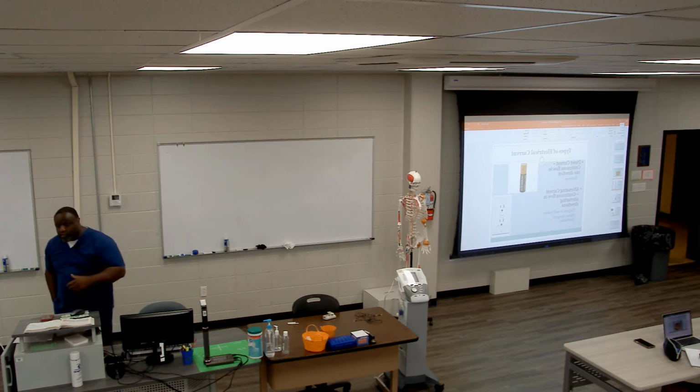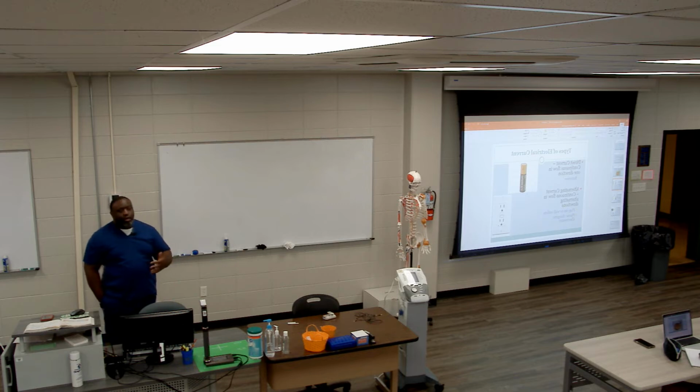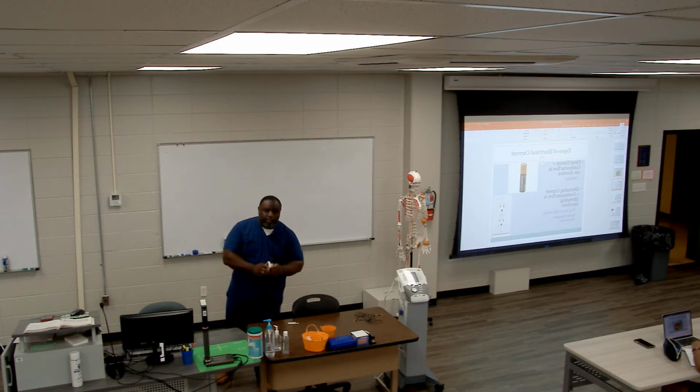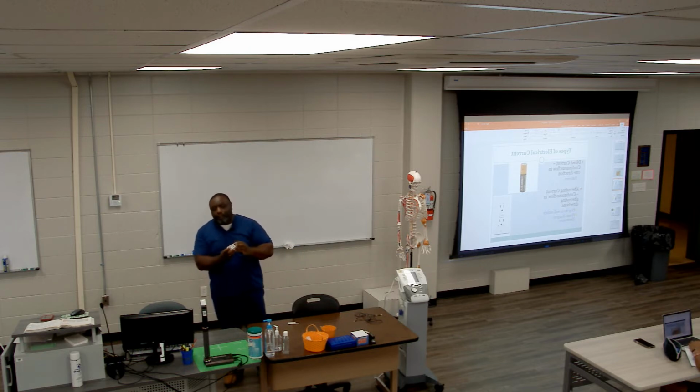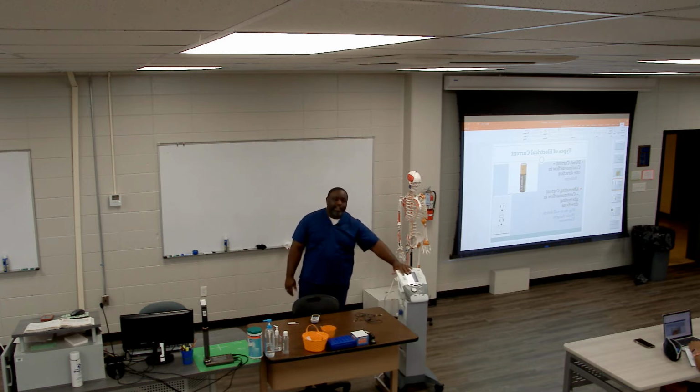So those are the two ways that we will actually get current from a device to a patient. Some devices will use direct current, and they're usually called portable devices. And some devices are plug-in devices and they use alternating current.